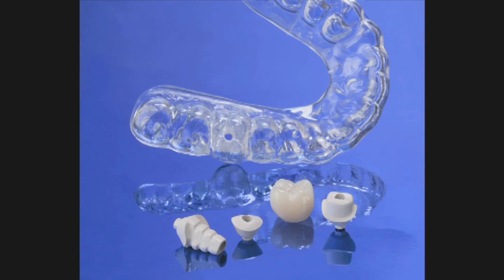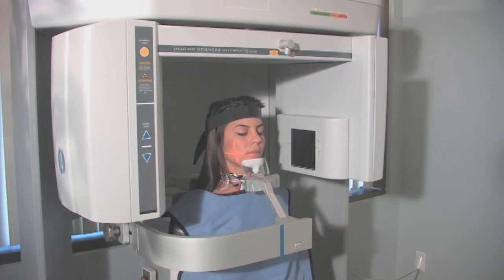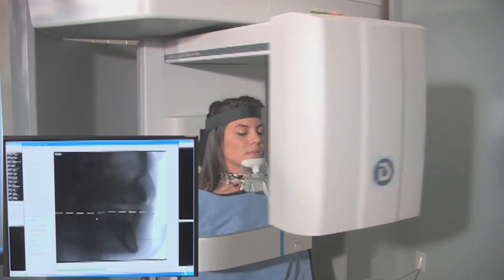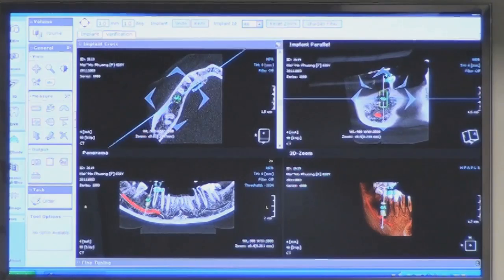Now, the inclusive tooth replacement solution described in our article does not necessarily require the use of a CT scan. A scan can provide accurate anatomic information that would otherwise be inaccessible, and this would eliminate the risks and simplify our surgery. Most of my patients seem to understand this and are willing to invest in a CT diagnostic procedure. Demonstrating virtual placement of an implant to our patients prior to ever touching that patient seems very logical to them.